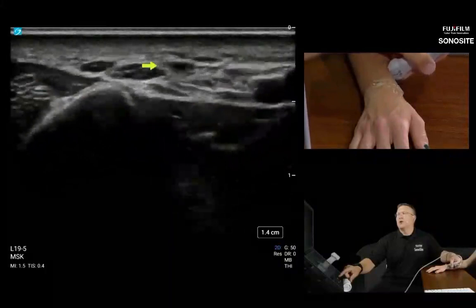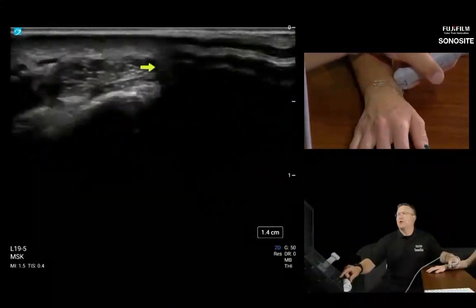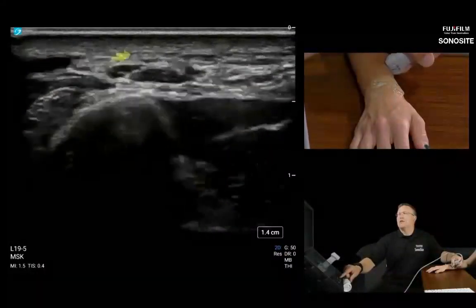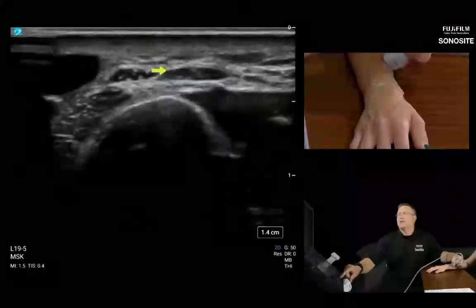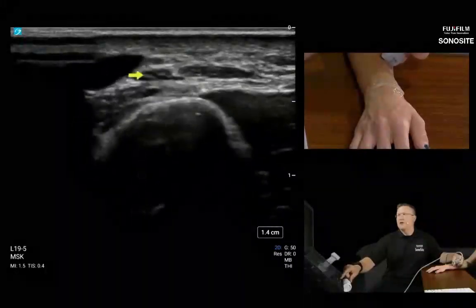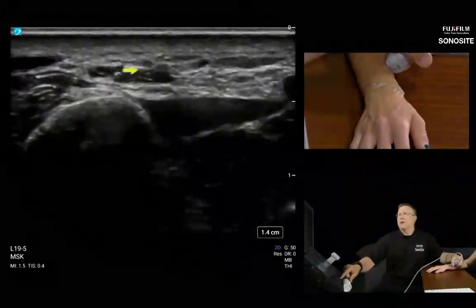When you're more proximal, it borders the cephalic. As you go distally, it wants to jump over compartment number 1. So go proximal to compartment 1, look at the cephalic vein. Here's the superficial radial nerve, and it's already bifurcated at this point. Here's one bifurcation here. This is a little off topic, but relevant for pain and burning in the area. You can see all the little fascicles here. As we go distally, you'll see it bifurcates right there.